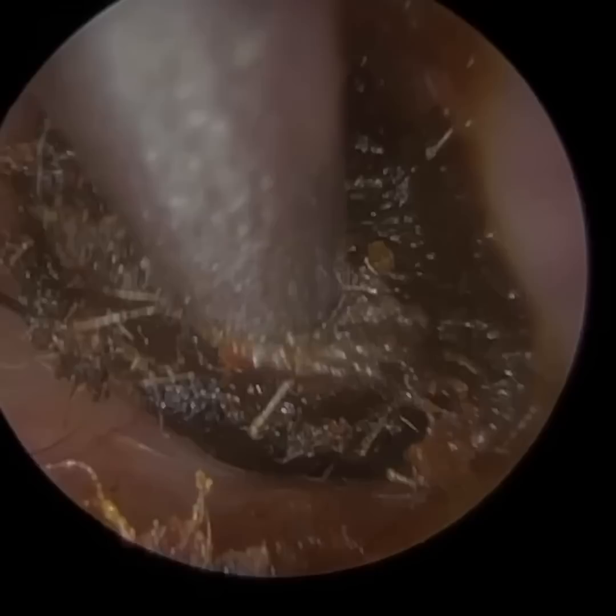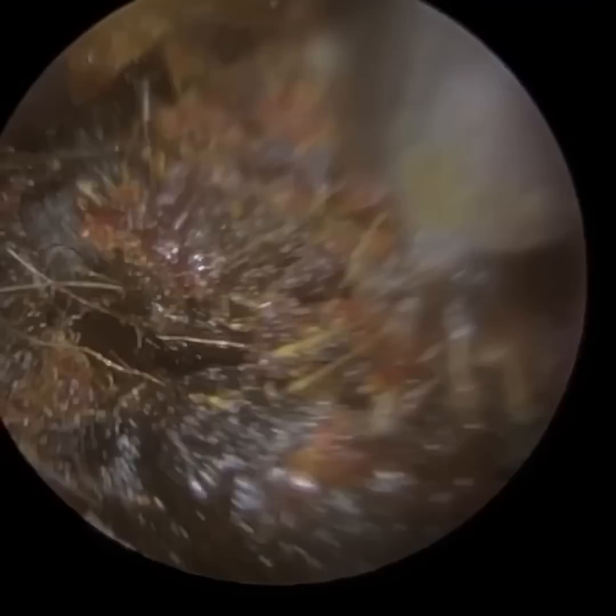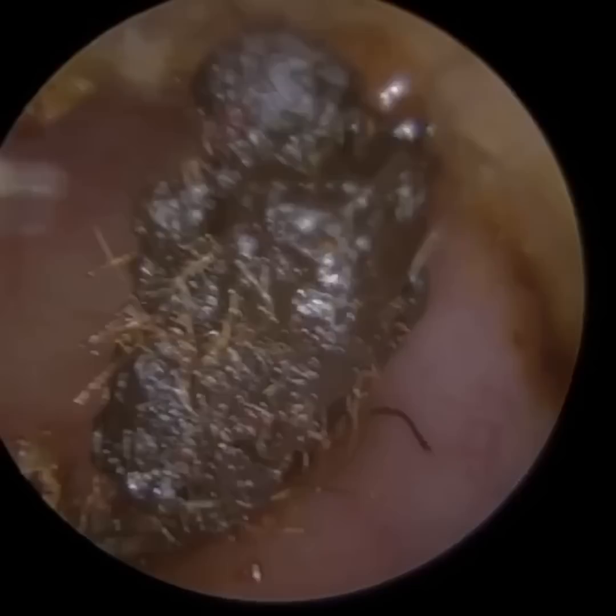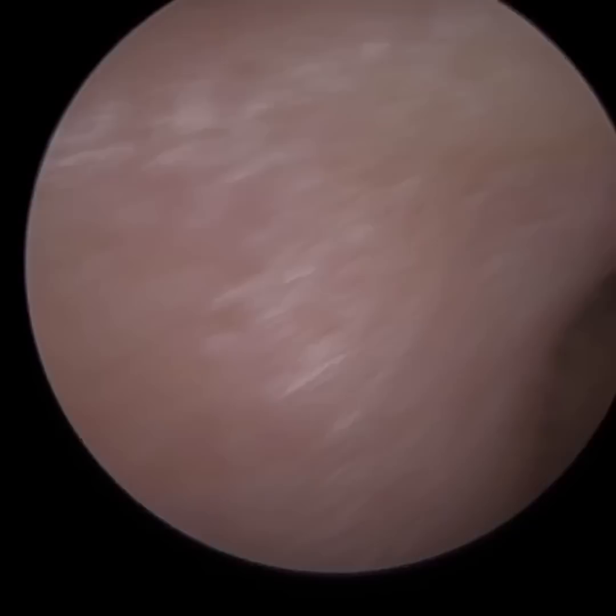So I'm just trying to tease this — this is a bit more blocked in there. I'm just lifting it up out of that inferior recess. You can see at the bottom, that was lodged in the inferior recess. And near the eardrum was a little trench, a little basin, a little dip, and the wax just got trapped in there. So I was definitely lifting it up and out. There's a bit somewhere around the edge, but I'm not too concerned by that. The eardrum is nice and healthy.